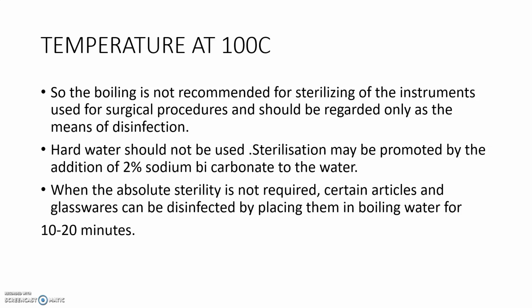But boiling is not recommended for sterilizing the instruments used for surgical procedures, because there is a need of absolute sterility. So it should be regarded only as a means of disinfection. So this method is regarded as a means of disinfection.